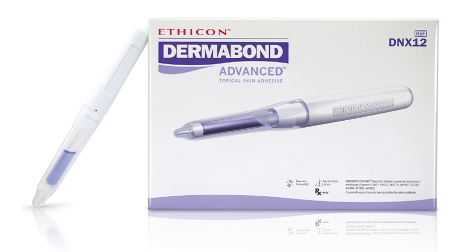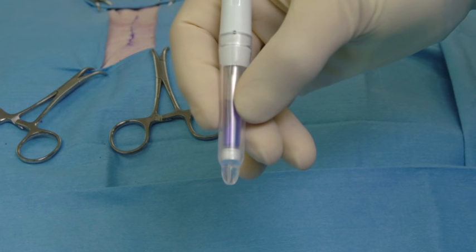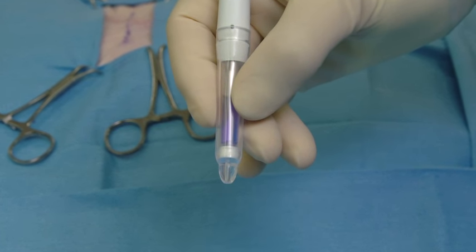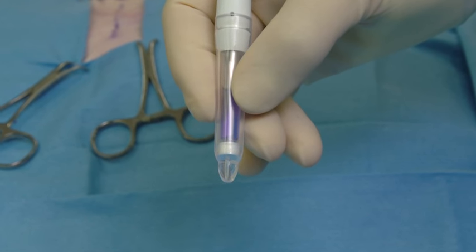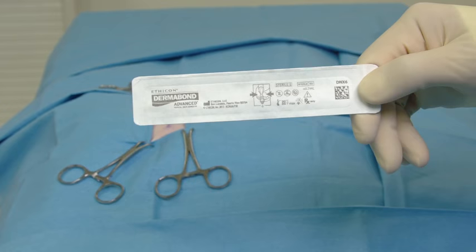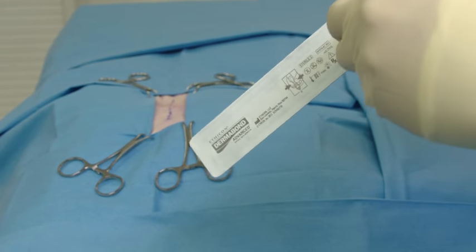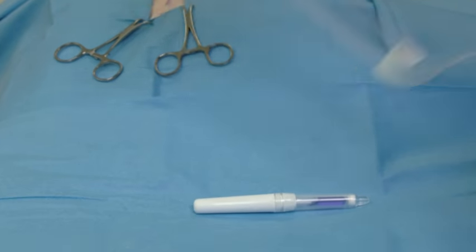Dermabond Advanced is a sterile topical skin adhesive. The one-time-use device is comprised of a glass ampule filled with a unique and proprietary adhesive formulation contained inside the bulb of the applicator. To prepare the product, first open the package and transfer the applicator to the sterile field using aseptic technique.